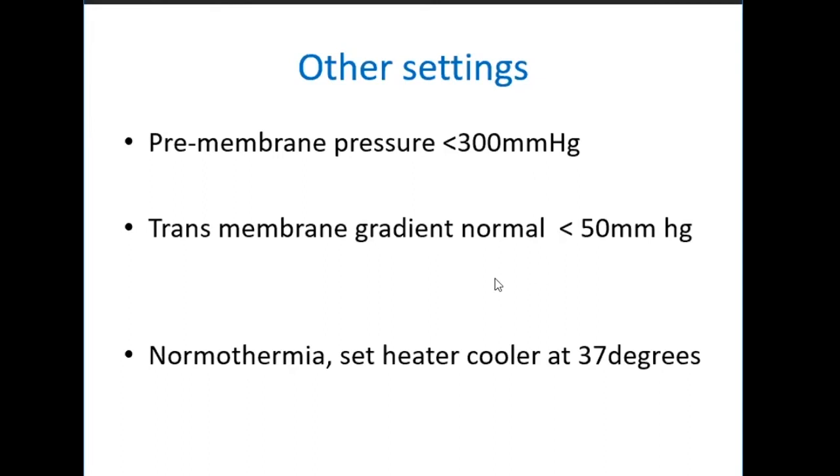So these pressures should be monitored, and we are continuously monitoring these pressures in ECMO patients. They are the most vital part of ECMO therapy, and this is the work of a perfusionist or the nursing staff who is looking after it, to monitor the pre-membrane and the post-membrane pressure and keep the gradient less than 50.